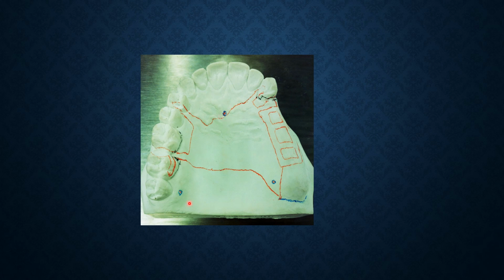Guys, this is the tripod marks. Exactly like that, you put a round and you put an X. You do tripoding, and during the surveying procedure you can place the cast back in the position all the time. This is just the diagnostic or primary cast, and you have drawn the design of the framework you want.